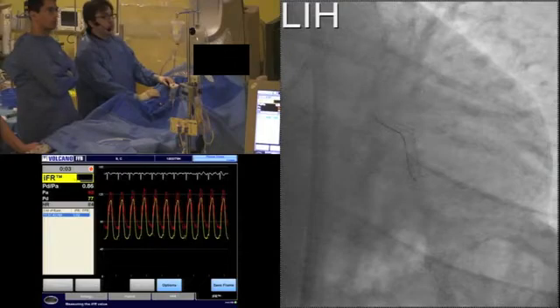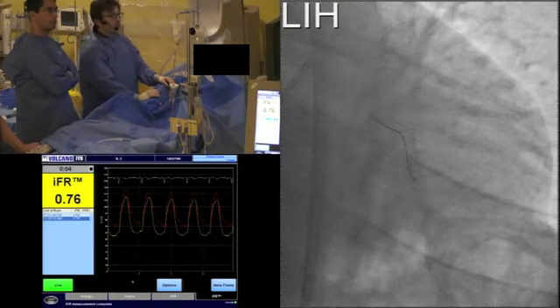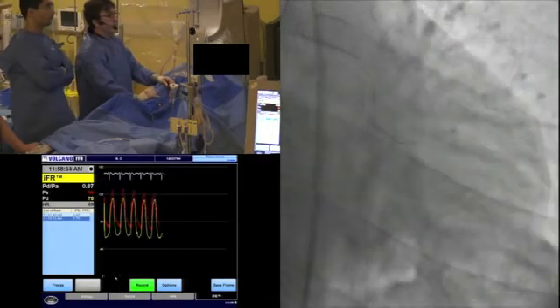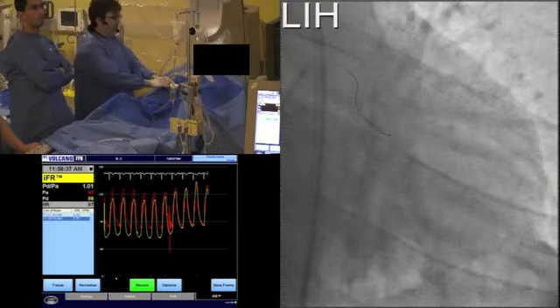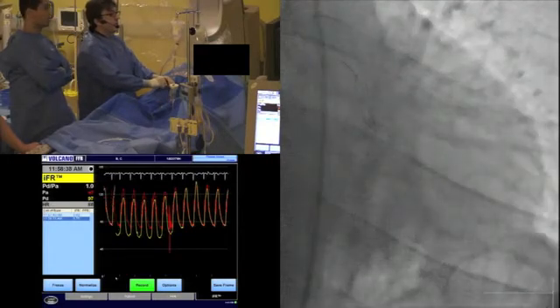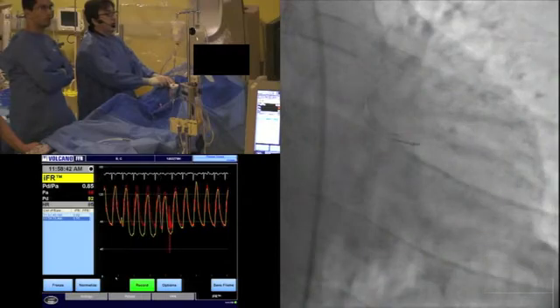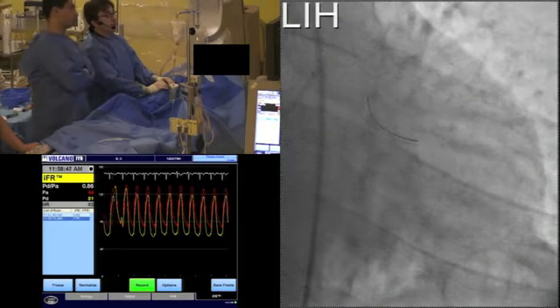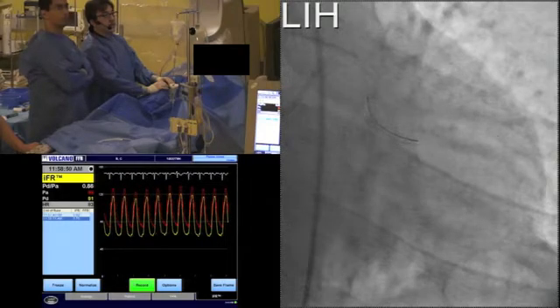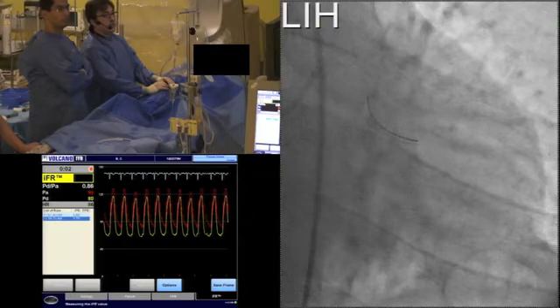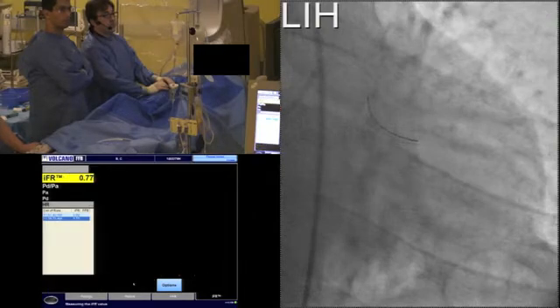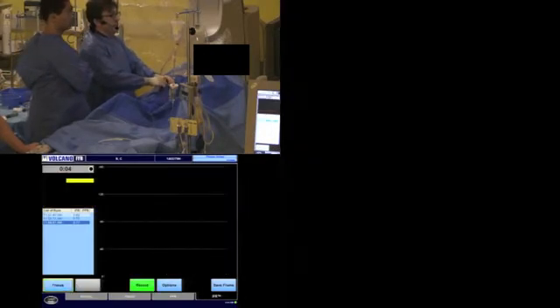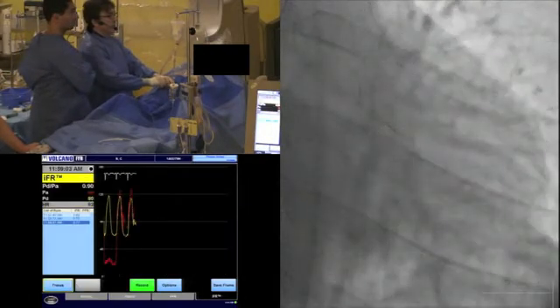So if you can make another measurement for me here. 0.76 there. And then we go just into the ostium of the circumflex artery. So actually that distal left main stem circumflex is very significant. Make another measurement for me there, Kevin. That's great. And that's going to be very significant as well.